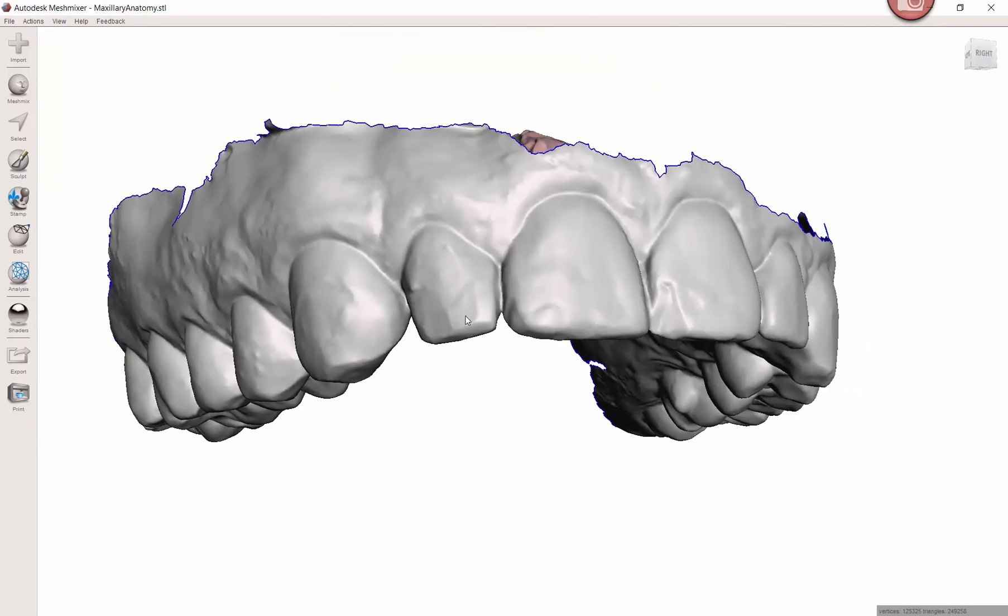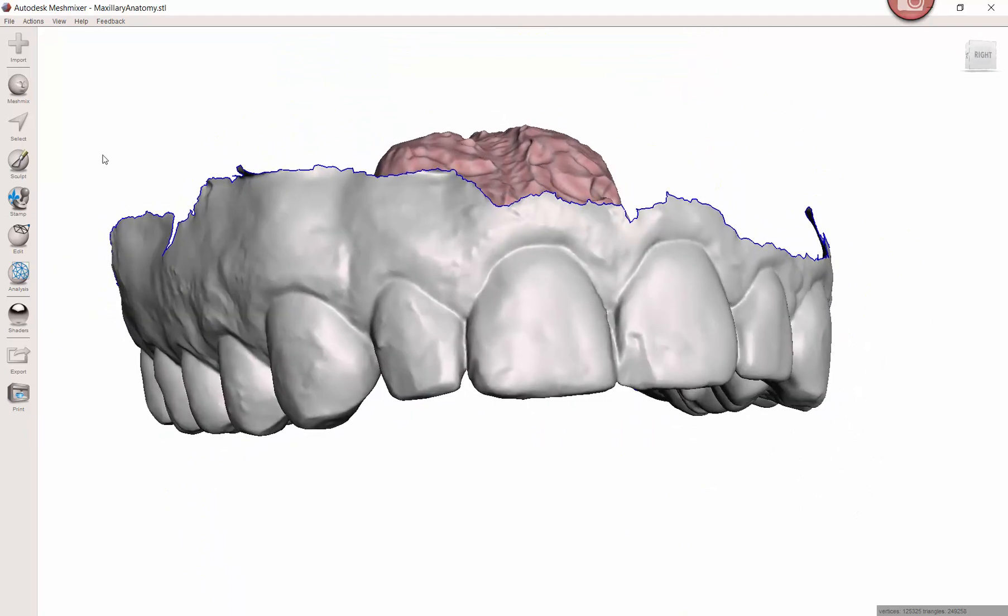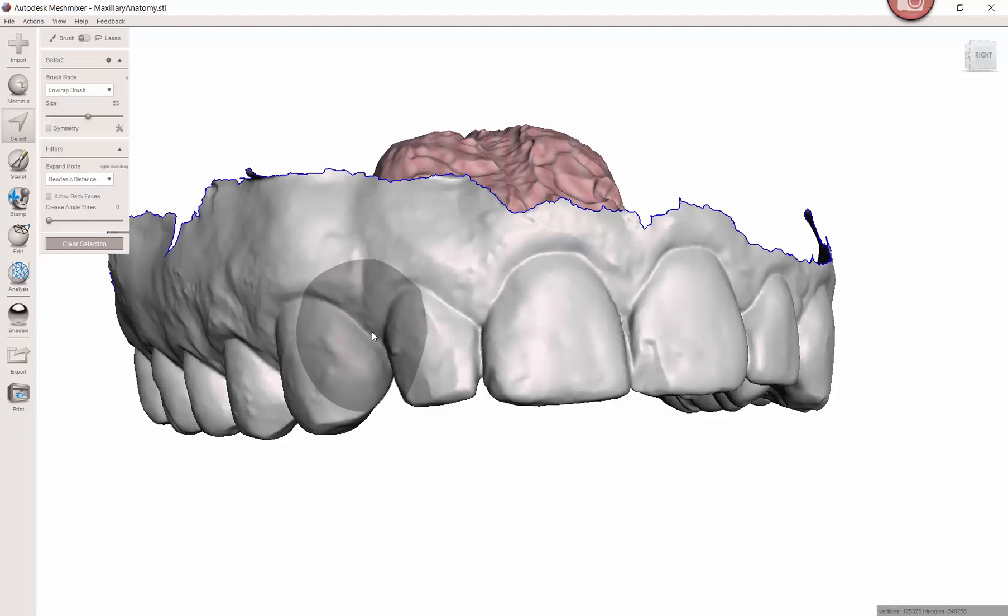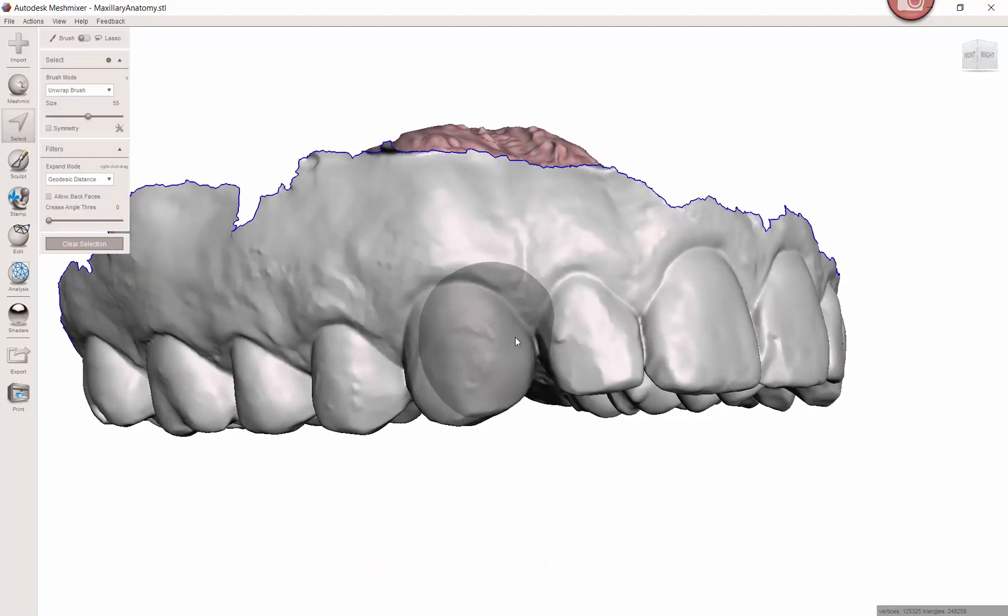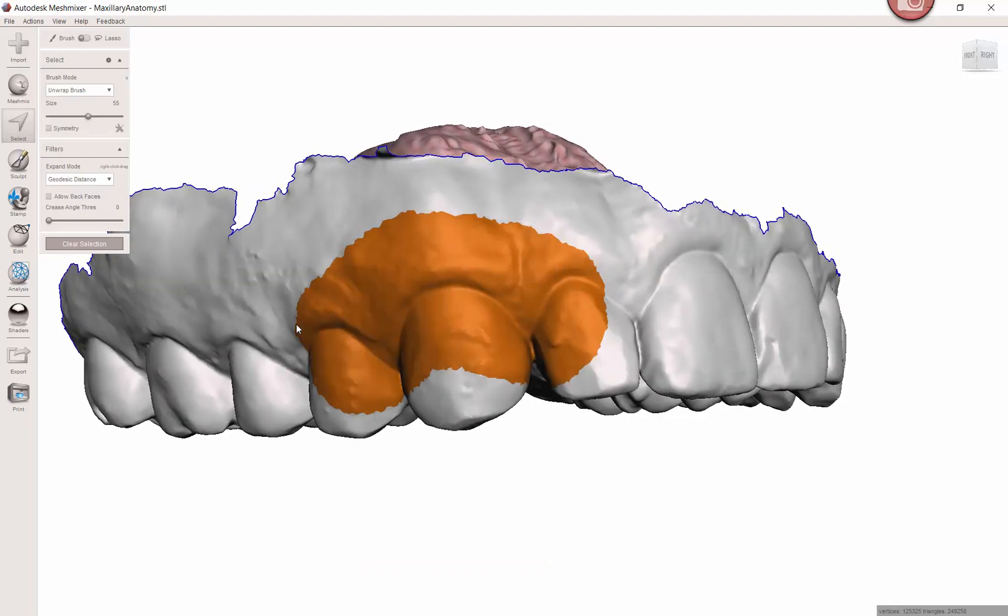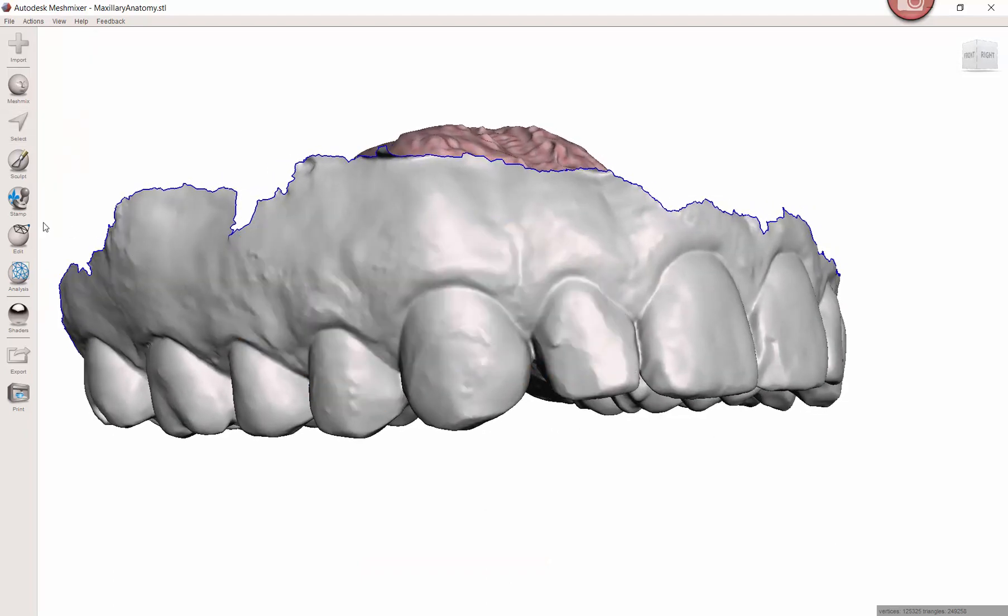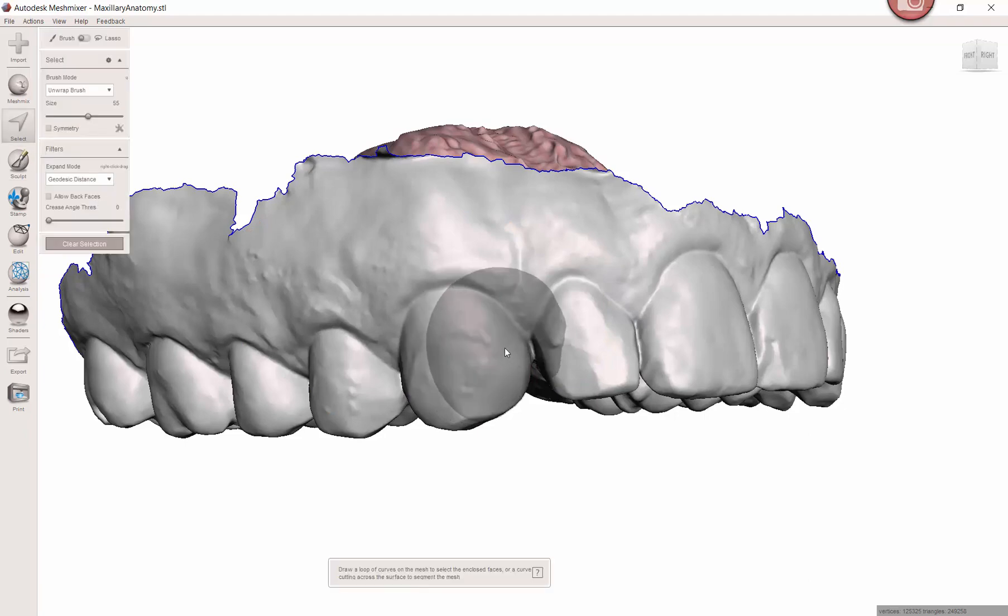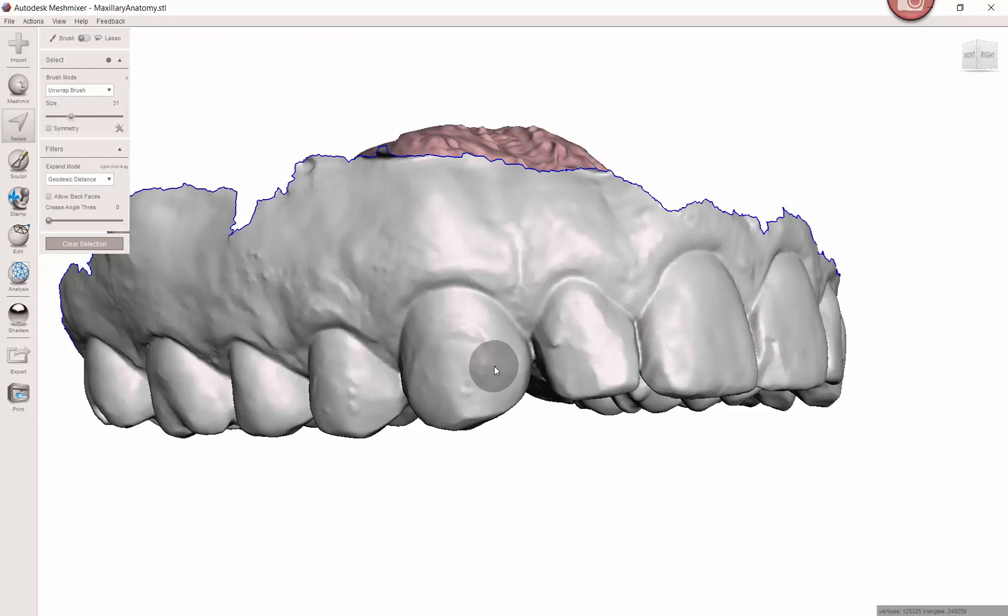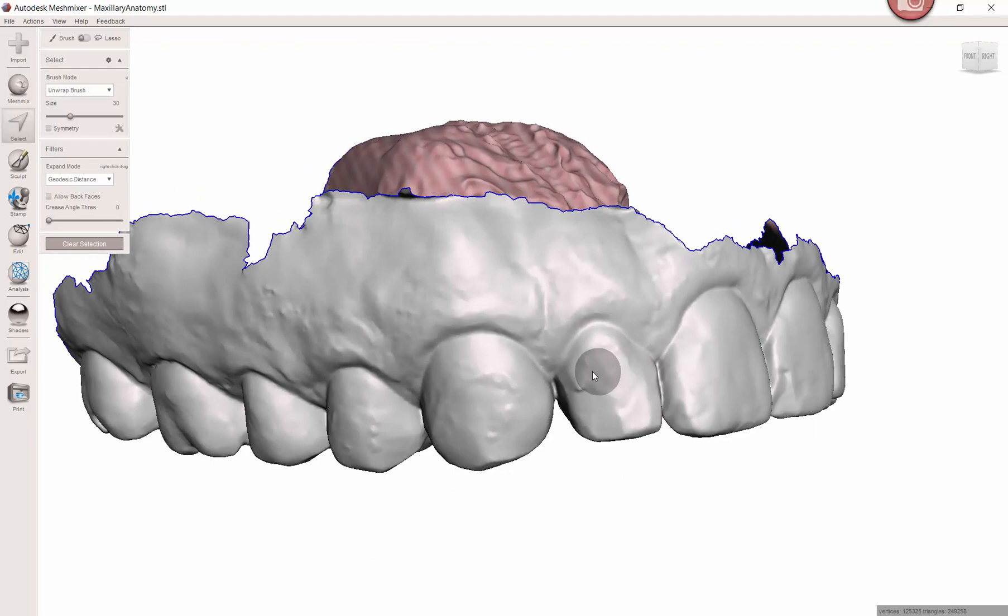To do so, I'm going to click the select button or press the S key, which is the shortcut. This selection area I can highlight, hit escape and it clears away. I can dial it down smaller or use the bracket buttons on my keyboard to make it bigger and smaller. Now I'm going to highlight the tooth.